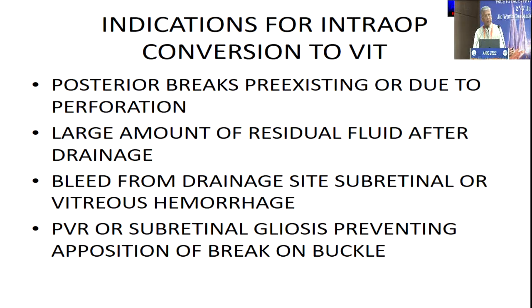However, one must remember that a buckle is a very forgiving surgery. There are many times when rather than going in at the same sitting, we may decide to just keep the buckle, see the patient again, maybe a couple of weeks or a month down the line, go in and do a vitrectomy and achieve again a good result.